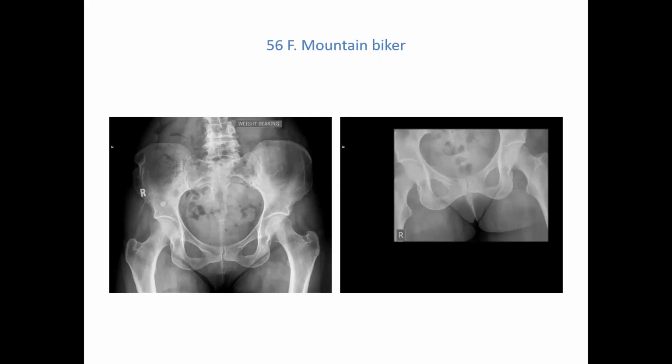Yeah, okay, fine. Look, again, there's an answer before tonight and an answer after the talk, but what would you have done in reality, given those x-rays of the pelvis? Well, based on these x-rays, I probably would have given the patient appropriate analgesia and physiotherapy in either the emergency unit or as an inpatient until they're fit for possible discharge via physio with an assistive device, can straight leg raise, etc. And I'd probably follow them up as an outpatient. That would be my thinking before this evening.